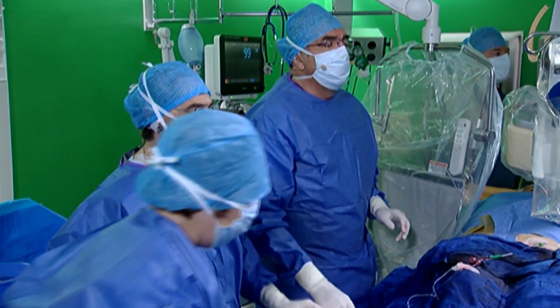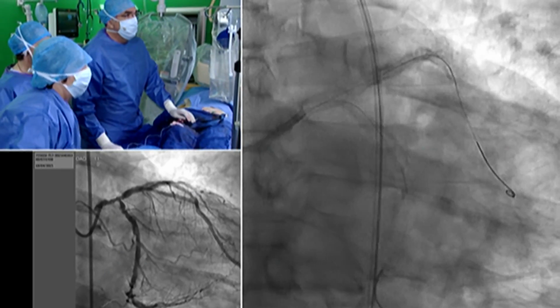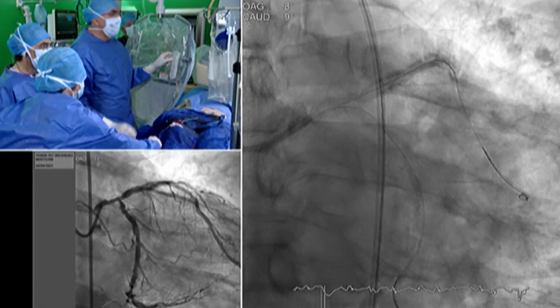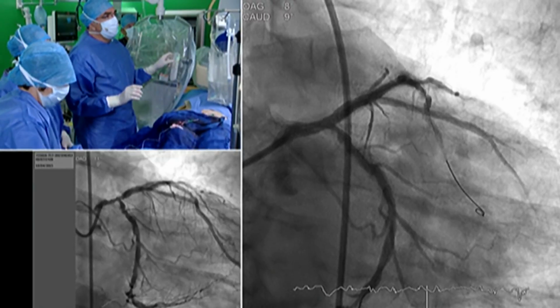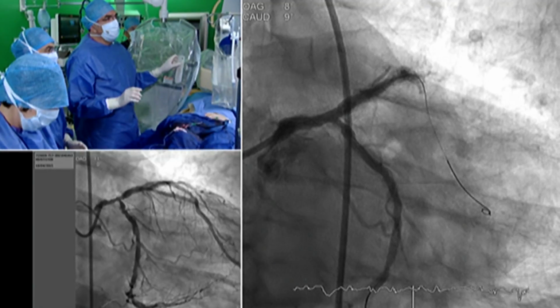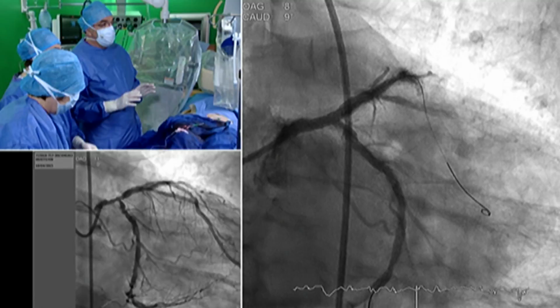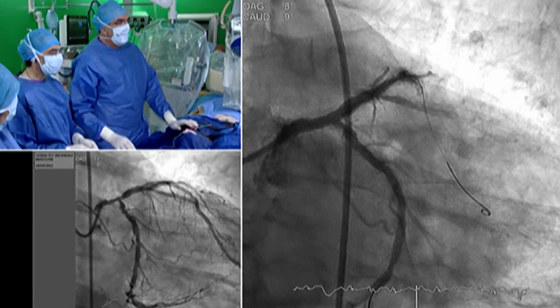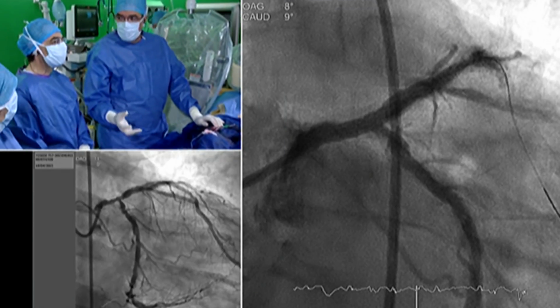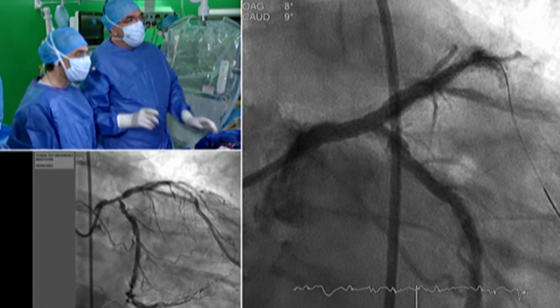Okay, big shoot, no distal embolization. Now it's not too bad. At the end, we are sure that we will take a 3.5 millimeter stent for the circumflex because it's a large dominant. Very big. So what we could do is to take a 3.0 and go up to 3.5. It should be easier to cross.